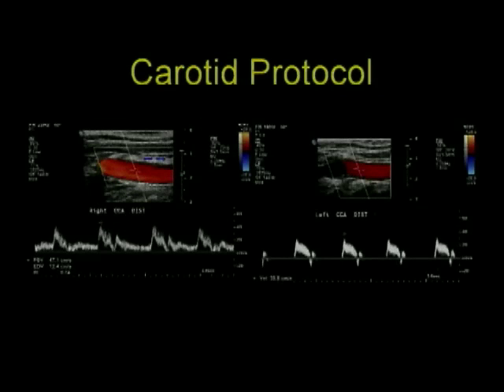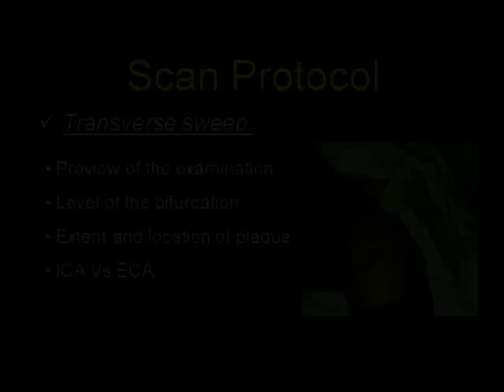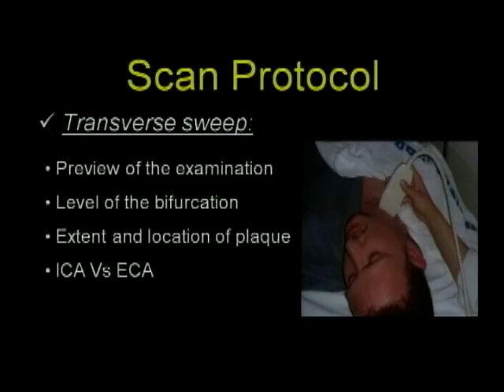of interrogation. And this is a nice example where we have sample volumes placed in an area of the carotid artery that does appear to be normal, but you do see significant difference in the waveforms right compared to left. And this type of finding in the left should immediately clue you in to the probability that there's something going on distally, although you're not looking at the distal portion of the carotid artery itself. So it does provide very important information.